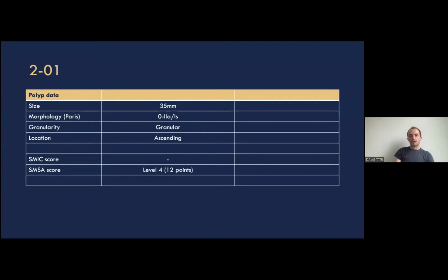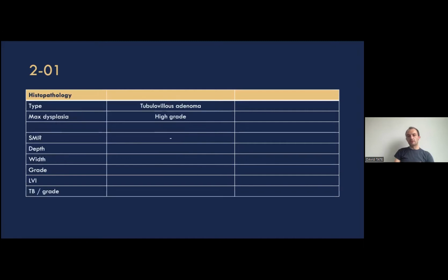So this is not a polyp to be attempting on your own at home. This is a polyp to discuss with an interventional endoscopist, and don't just make a start on such a thing, because you will end up in trouble, you will have problems, and the patient will get a negative outcome from it. Okay, just skip to the next one for me, Vikash.